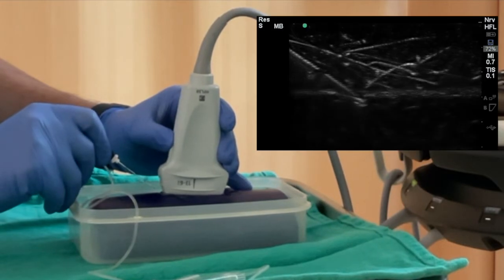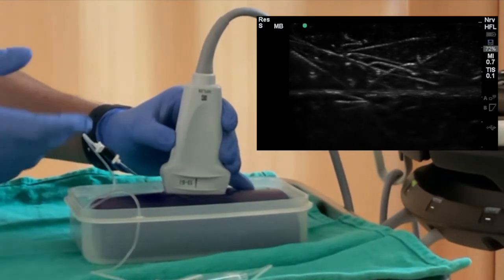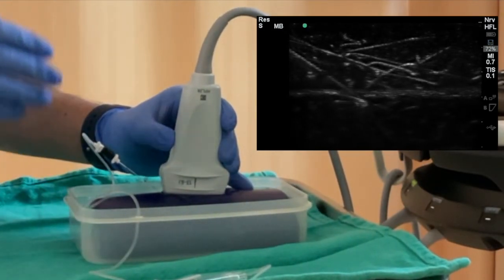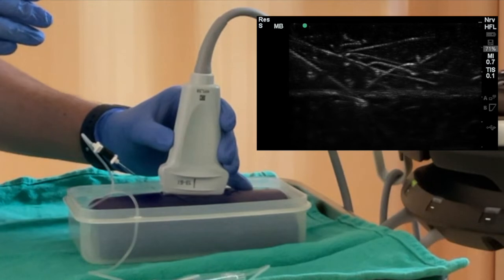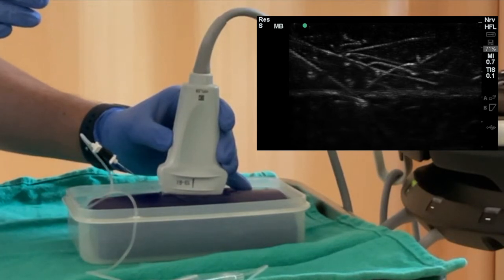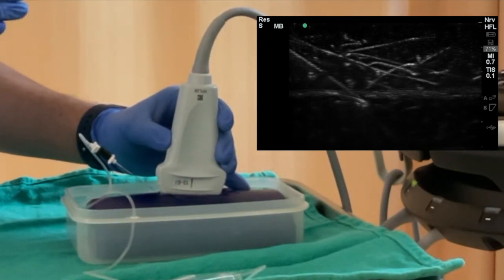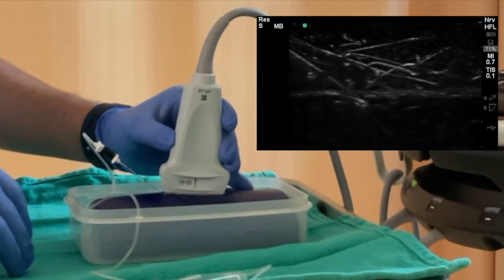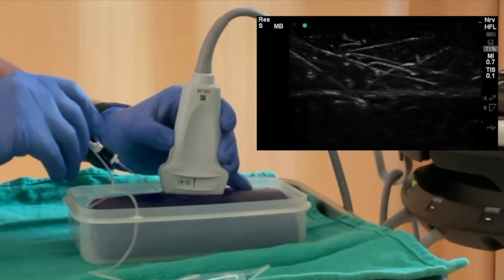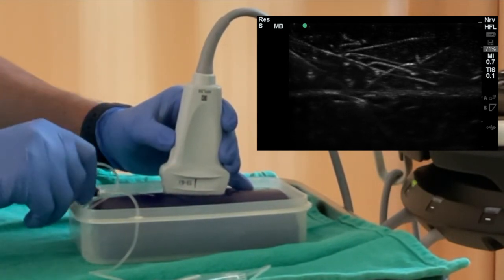The to and fro movement of the needle can help identification of the needle tip. Similarly, up and down movement or seesaw movement of the needle also serves the same purpose.